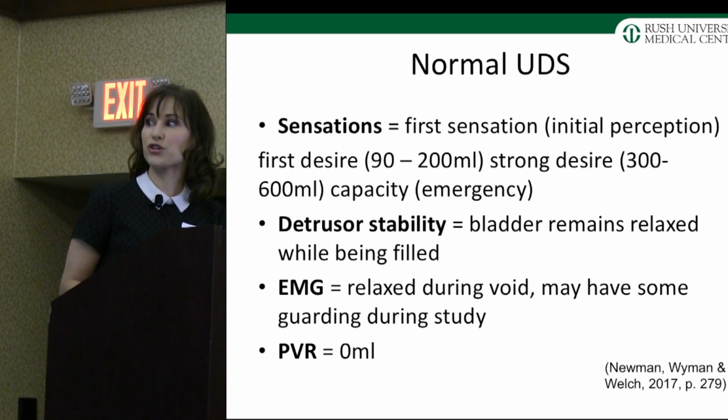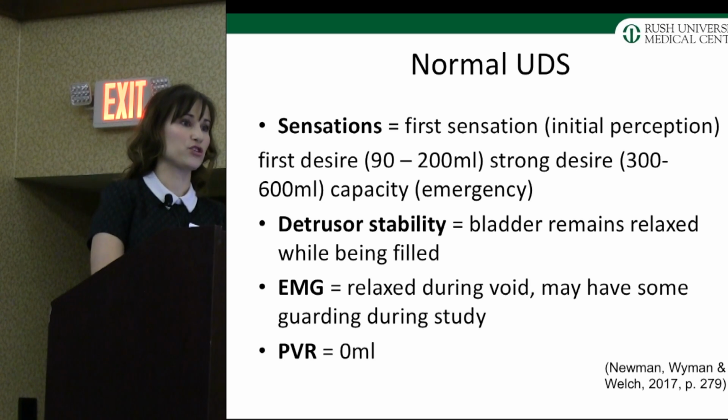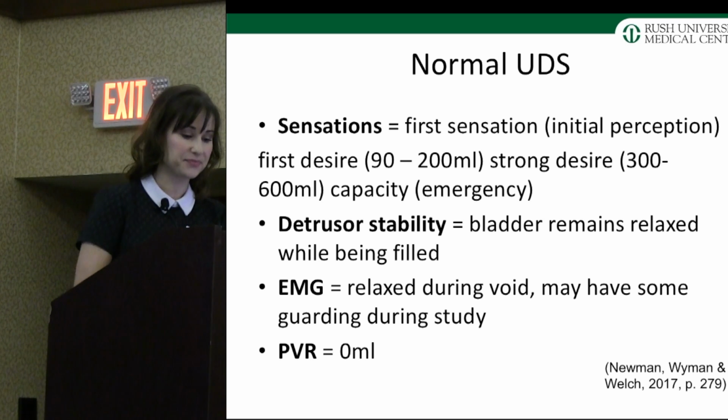When we talk about detrusor stability, we're seeing if the bladder remains relaxed while being filled. The bladder should not be contracting while it's filling. If it does, then we might call that an unstable bladder.